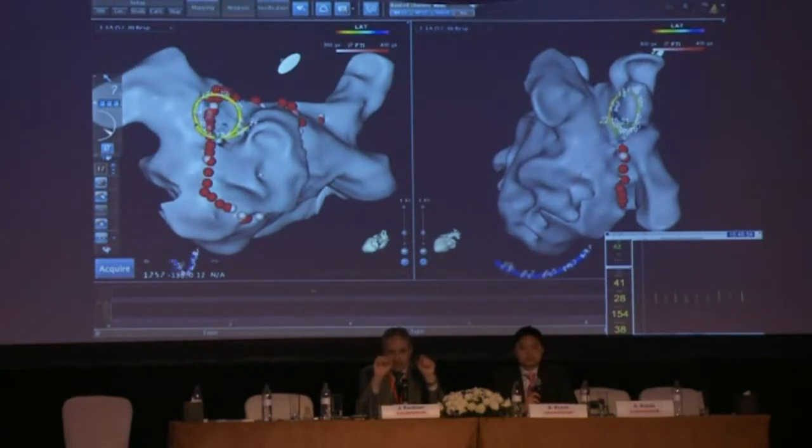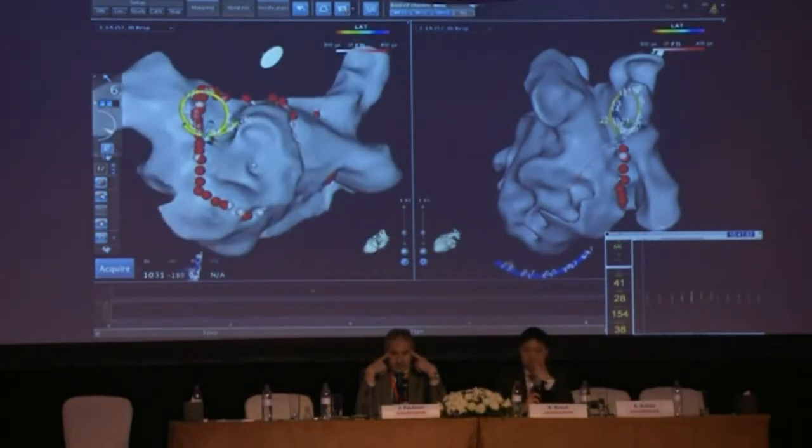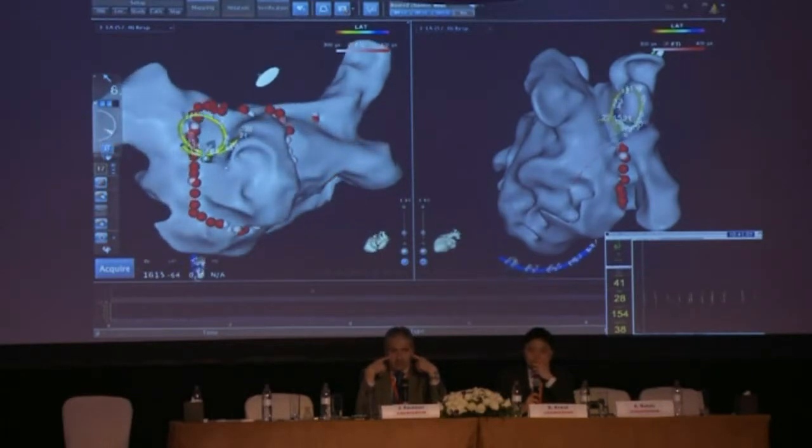Yeah, sorry to interrupt. While we're talking, I just want to point out that as predicted, I've completed the line. I've gone onto this area here, and you can see the vectors going up, so I'm on the lower vein side of this junction between the upper and lower vein and the ridge. If you look at the BARD, we can see a fairly fractionated signal here.